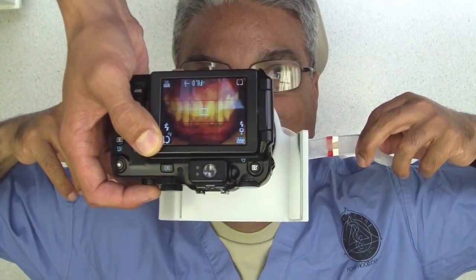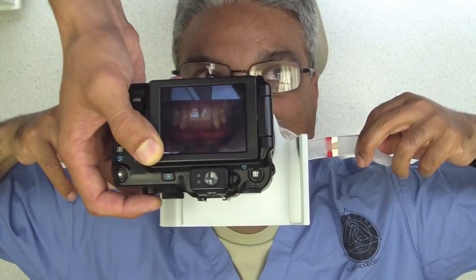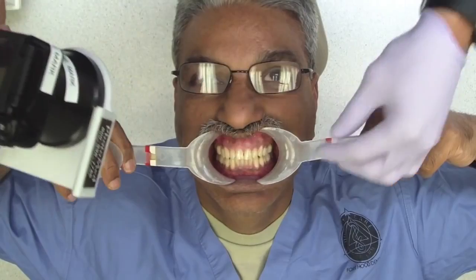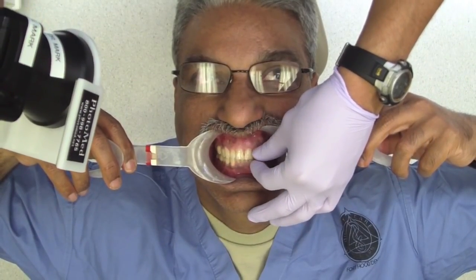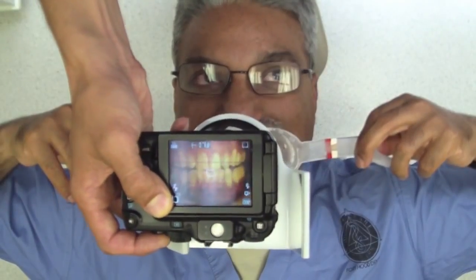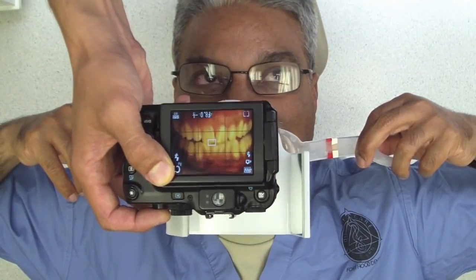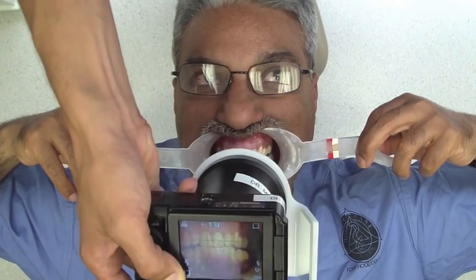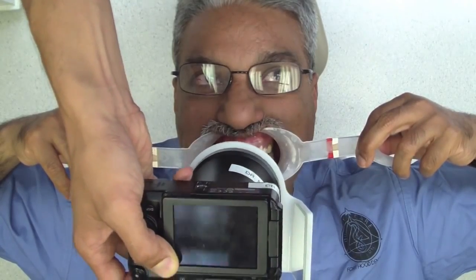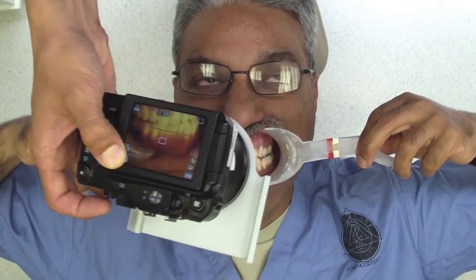So what we're looking for is just to make sure that some folks at the beginning get the patient to bite down. Some folks get them to slide your jaw forward. Just bite down, slide your jaw forward. Protrude all the way to their edge to edge. There we go. Some folks get edge to edge photos for more aesthetic shots before and after. You can see how we're getting glare on some of the central incisors, so you can angle different angulation with the light change. If you have a more expensive camera, or you're more advanced, you can. If you're more advanced, you probably aren't listening to this.